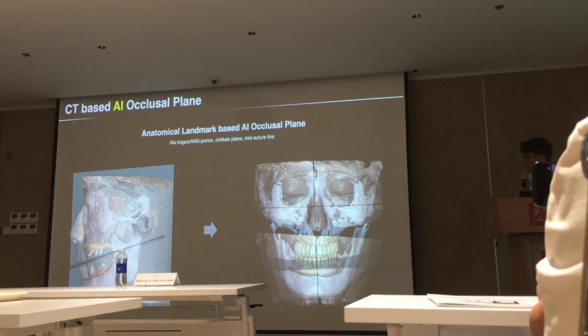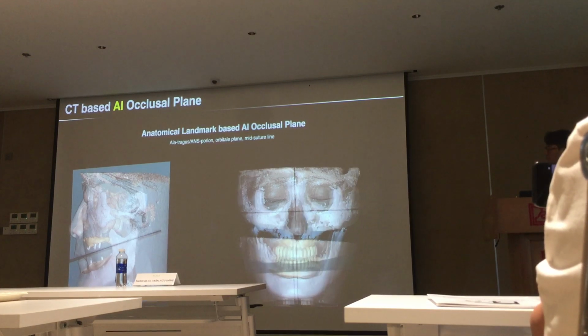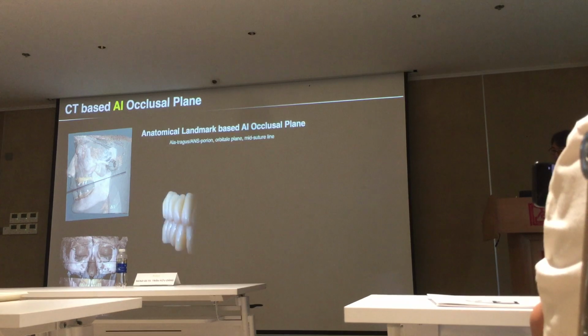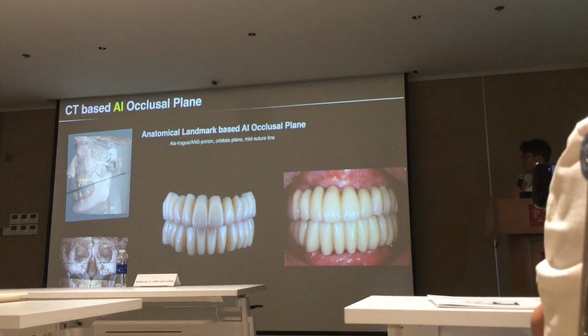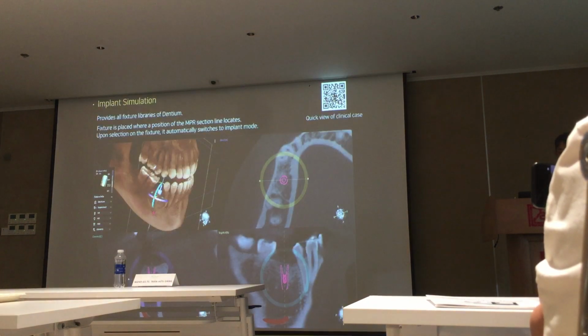So we can see from the front and from the lateral, and we can easily make this beautiful prosthesis.